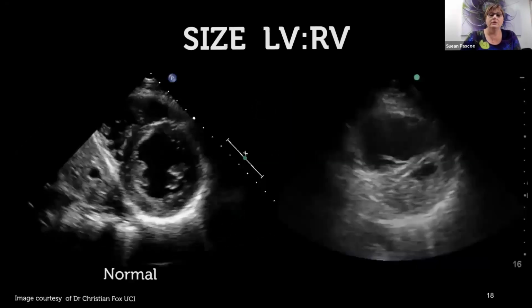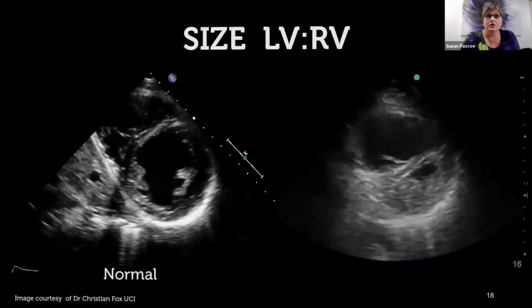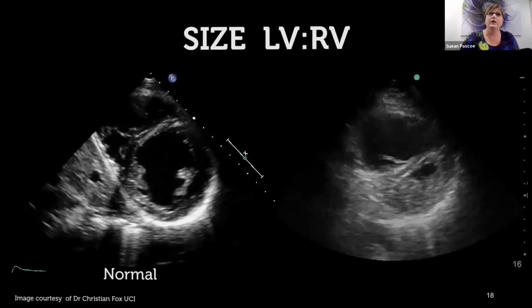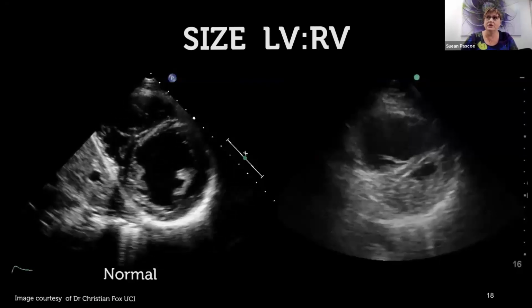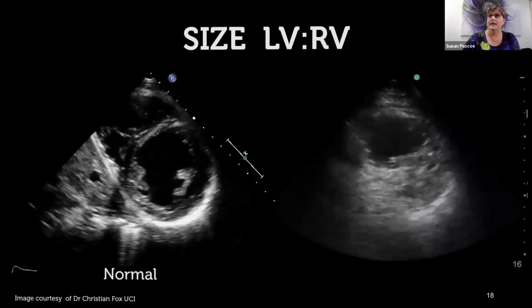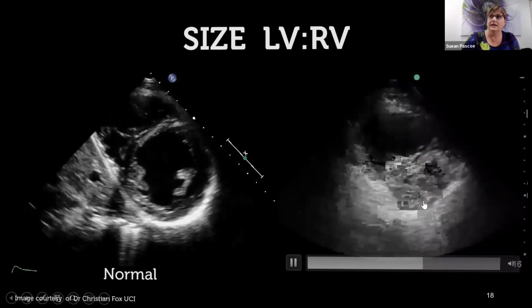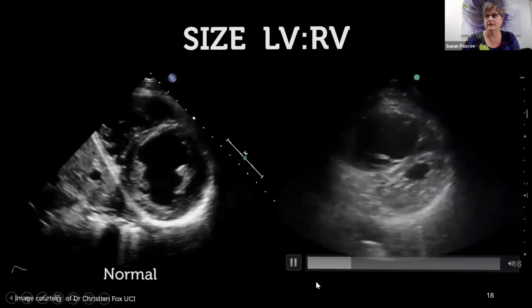So in the parasternal short axis view, the motion of the septum should be, all sides should be coming towards the middle as the heart squeezes. If we look at the ratio of the sizes between the left ventricle and the right ventricle, you can see here in this abnormal heart that the right ventricle is much bigger than the left. And we can also notice here that the left ventricle walls are really quite thickened.